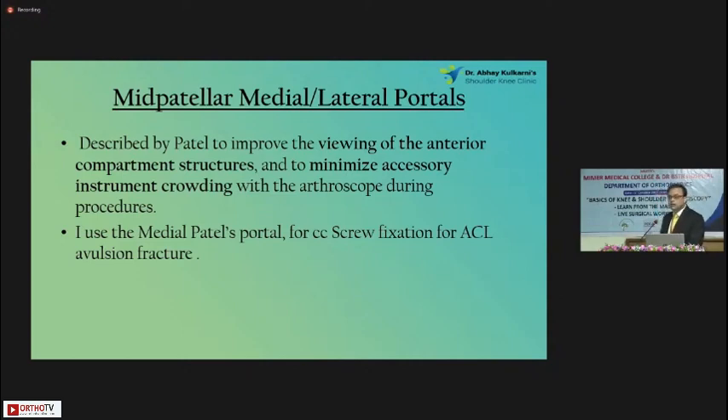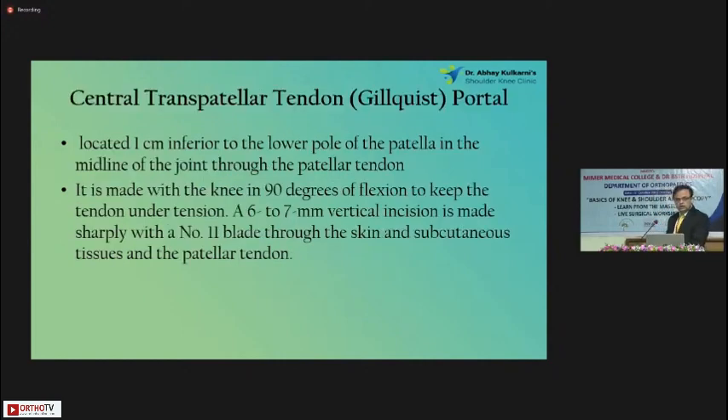Another portal is the central trans-patellar tendon portal — a very nice, versatile portal. We have to learn how to make this portal. It can be used for most things: whenever you're doing meniscus repairs, meniscectomy using double-portal techniques, and for ACLs and ACL avulsions. It should be made at 90 degrees of knee flexion because the tendon becomes taut just one centimeter below the inferior aspect of the patella — just make a vertical portal. I really recommend this portal; try to get into the habit of making it whenever needed.